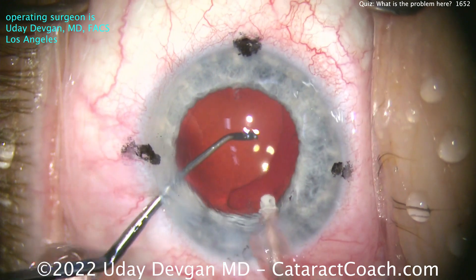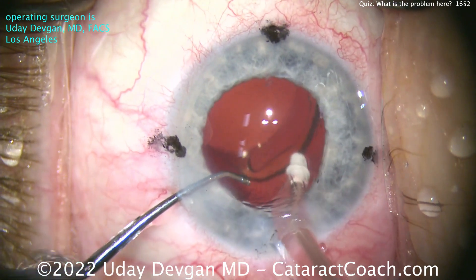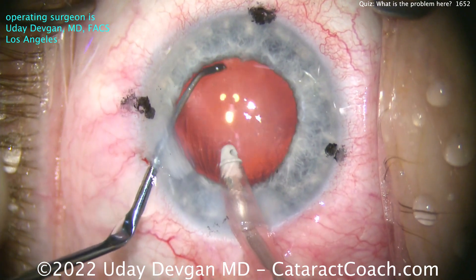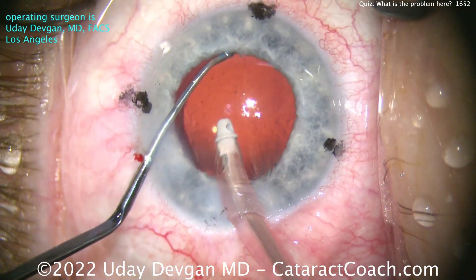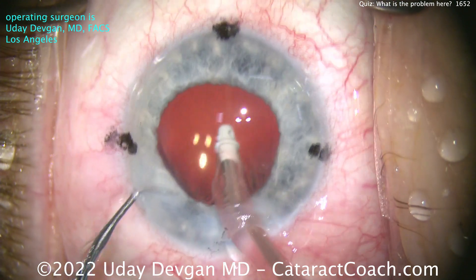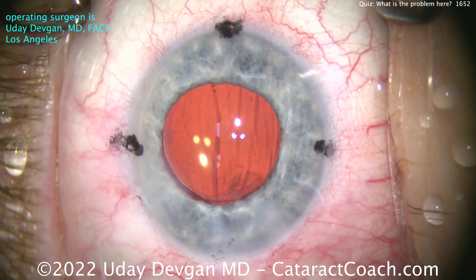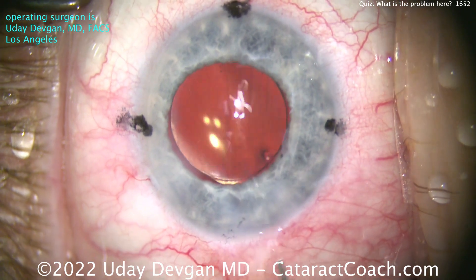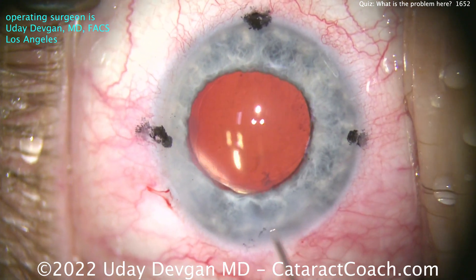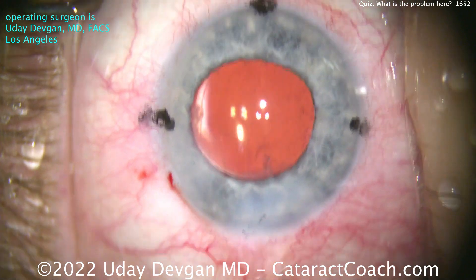It was just under the iris — that haptic was not in the bag. Now let's get it pushed in there. Let me use that second hand and dial that thing in. I need to make sure that haptic really goes under the rhexis and into the bag. Now I can push it in, and now I'm feeling a lot more confident. You can judge by the position of the capsulorhexis over the optic — it's looking good. Now the eye is well-centered, both haptics and the optic are completely within the capsular bag. You can see the rhexis over the optic, and the toric marks are pretty well lined up with the cornea.